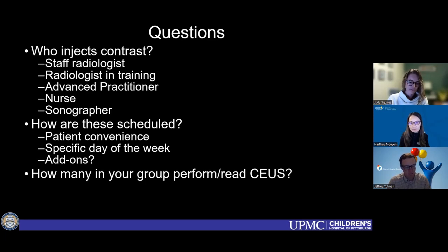At CHLA, it's staff radiologists. And a follow-up question: if radiologists in training or any kind of trainee are with us, sometimes we'll allow them to do the injection too. But do you have a select group, or does everybody in your groups do the injection or perform it or read it?